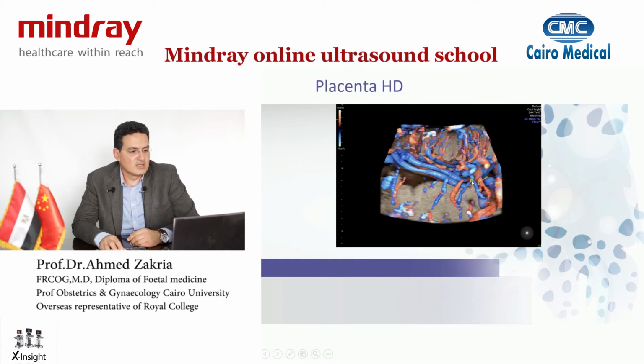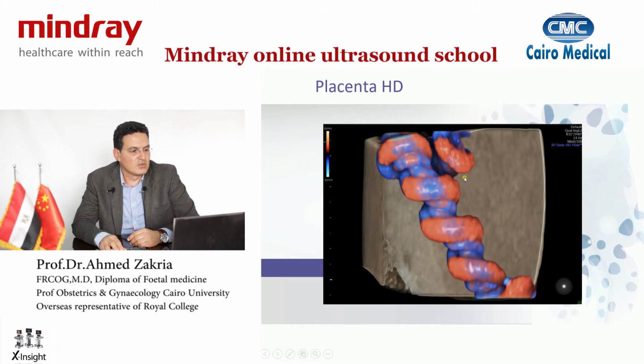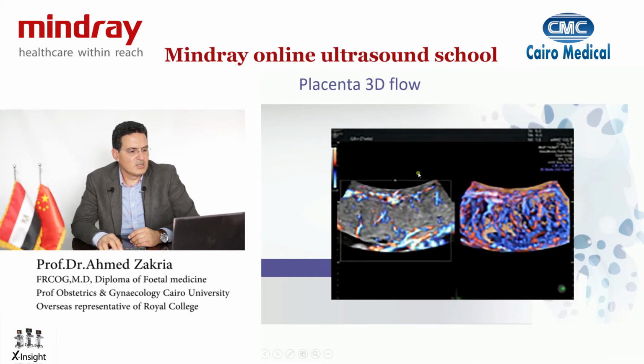Or you can actually see the structures of the placenta root, and the placental bed, and how the vessels go across it. You can see the different areas of the cord, define the cord insertion, and appreciate a little bit more about it. And in those images, what we do is actually we magnify the tissues of the soft tissue, and we dampen the structures around it, so you can actually show the vessels a bit more clearer. And here you can actually see all the vascular tree across the placentas, particularly with cases of abnormally high vascularity in the placenta and cases of invasive placenta.